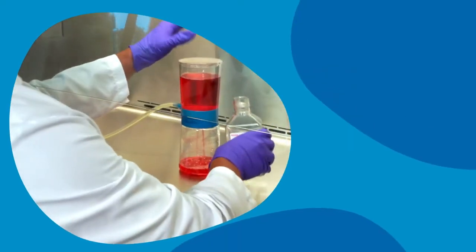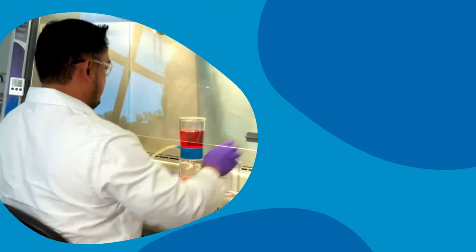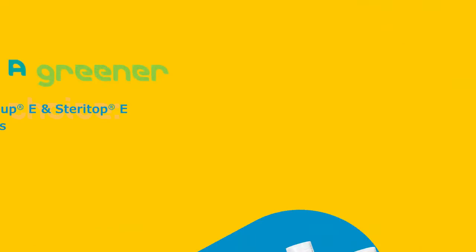When it comes to sterile media, life scientists have trusted SteriCup filters for decades. But like you, Millipore scientists care about much more than clean media. We're proud to introduce premium filtration devices designed to make a real difference in reducing plastic, packaging, and biohazardous waste.